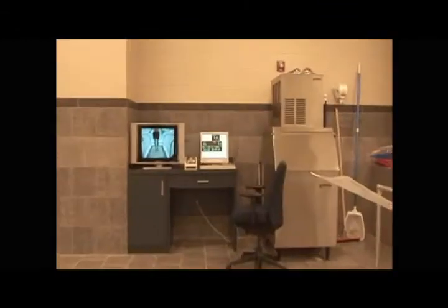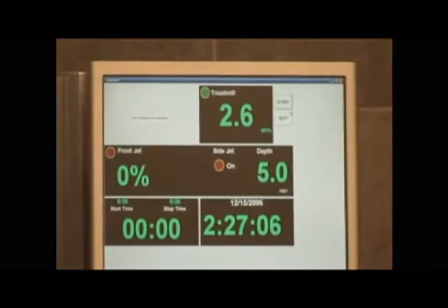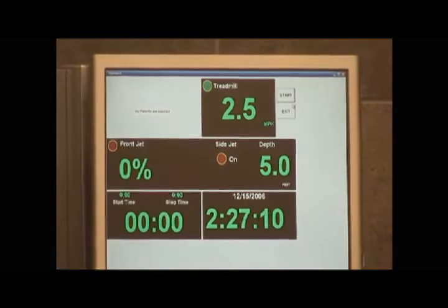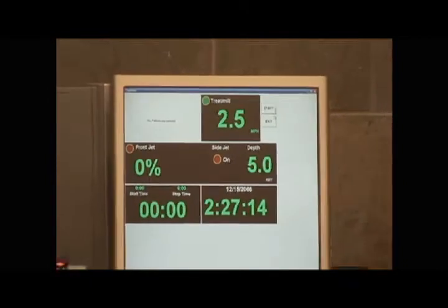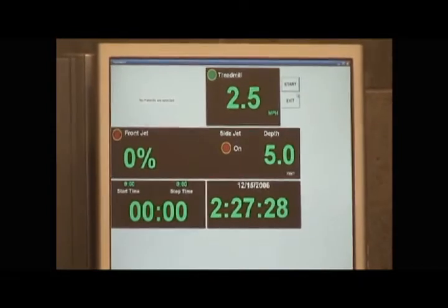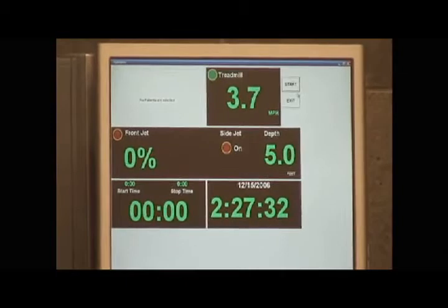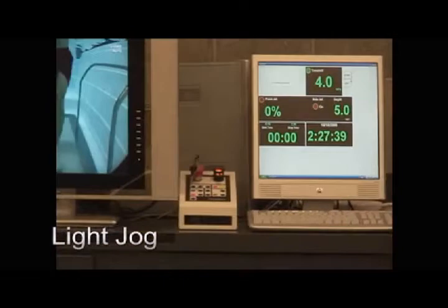For the next session, we started off walking for two minutes at two and a half miles an hour just to warm up. Then we started doing some jogging — started him off at four miles an hour, which was just a very light jog. Did that for about five minutes.